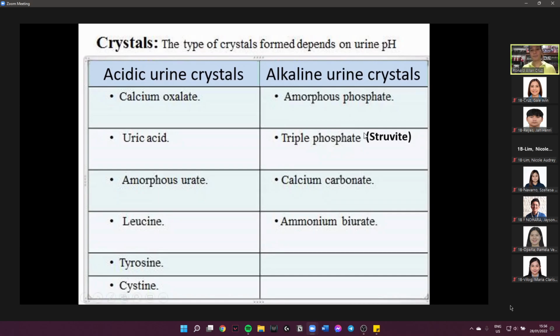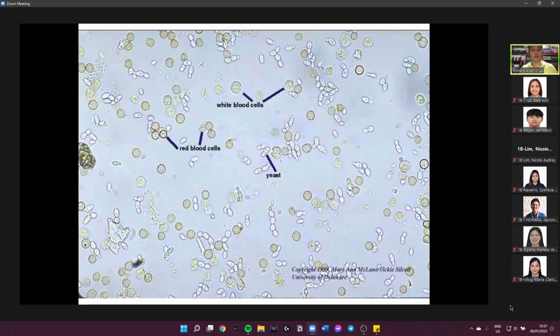One way of checking is you check again for consistencies, like what we've been mentioning since 3 o'clock. If you have, let's say, a struvite crystal, but then your pH is acidic, that's a little incongruent, things like that. Okay, so under the microscope, it could appear like this.